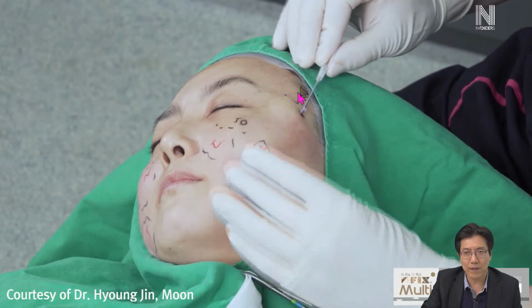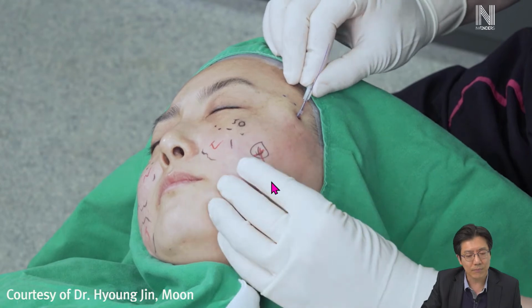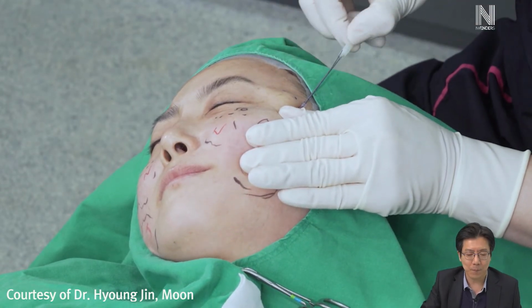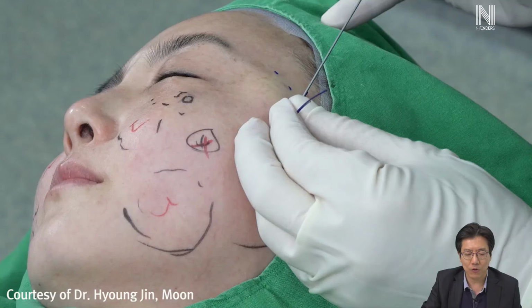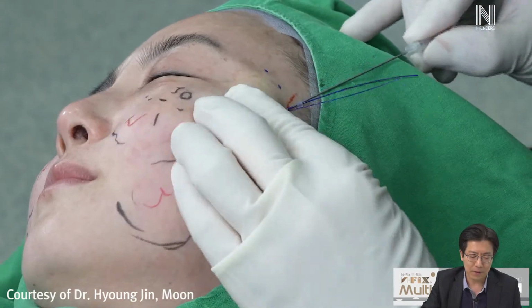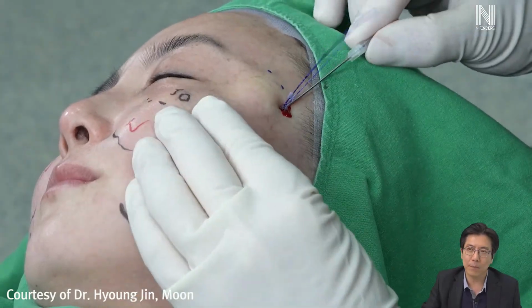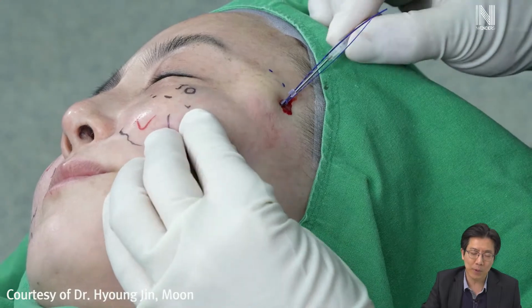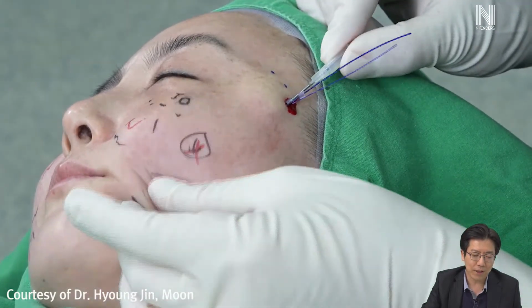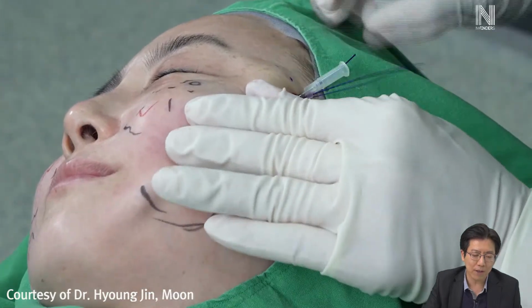So vector is always very important. The layer should be the deep subcutaneous layer. To be safe and to be correct, you should use your opposite hand fingers and apply the pinching anatomy technique. And you should check the location of the end of the cannula.